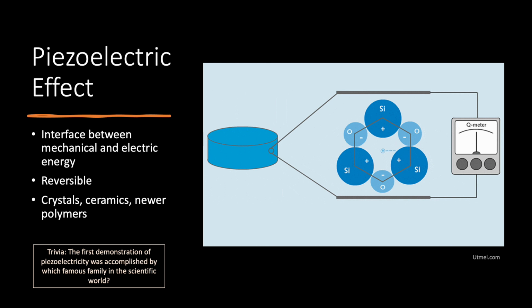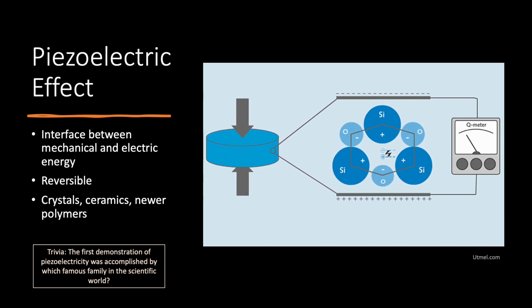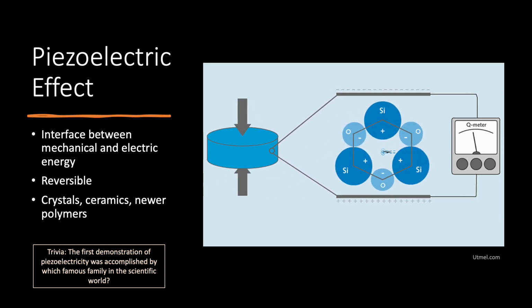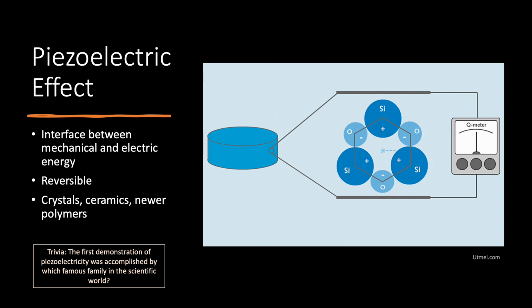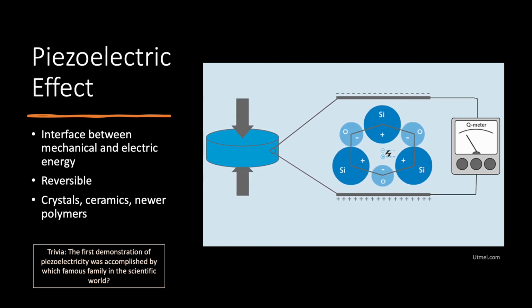So you can see these two plates are kind of being pushed together, demonstrating mechanical stress being imparted onto this crystal. And what happens when this occurs is that there's a small, though mighty, electric voltage that is generated. And then conversely, the same thing is true. If you applied an electrical voltage to the material, it would deform or vibrate, and that would create a mechanical energy. This effect is due to the way the atoms are arranged inside the material.